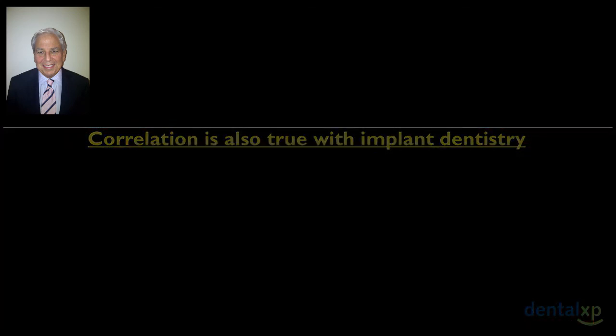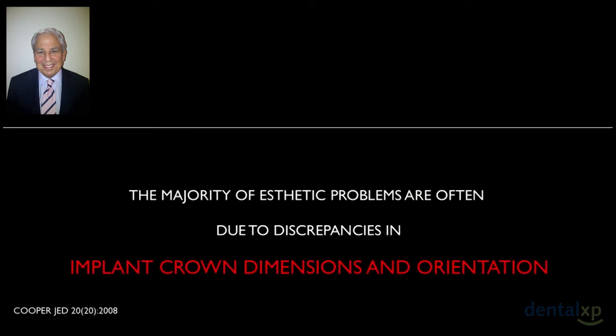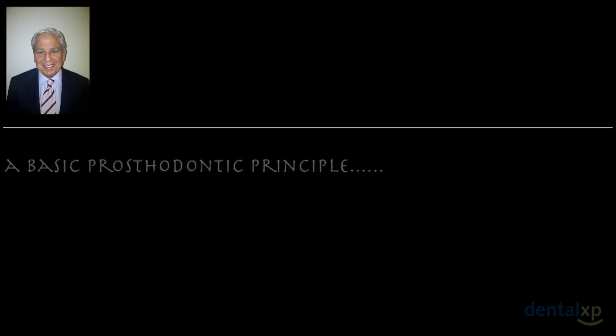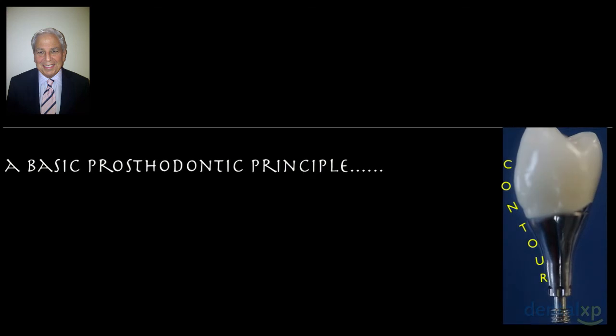This correlation is also true with implant dentistry. And I think a great quote that Lyndon Cooper had is that the majority of aesthetic problems are often due to discrepancies in implant crown dimensions and orientation. So I want to discuss a basic prosthodontic principle that we don't talk enough about, and that is contour, the contour of the crown.